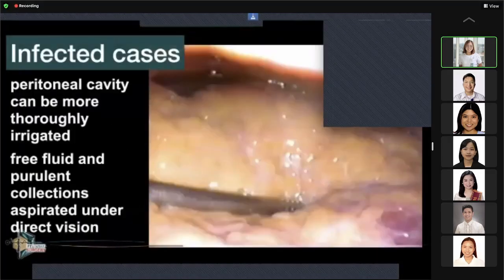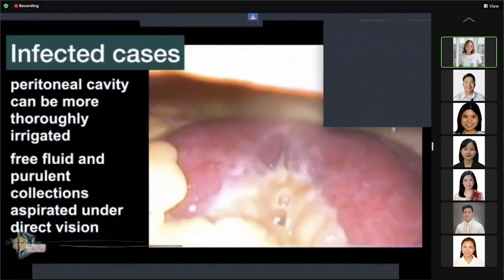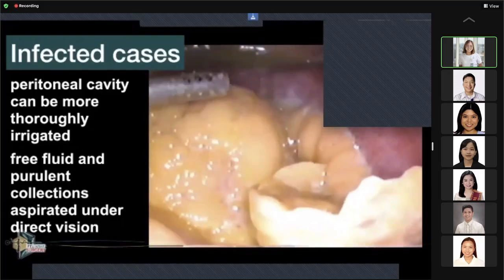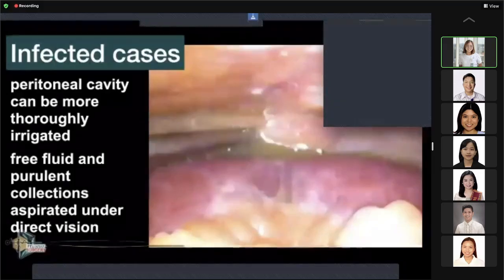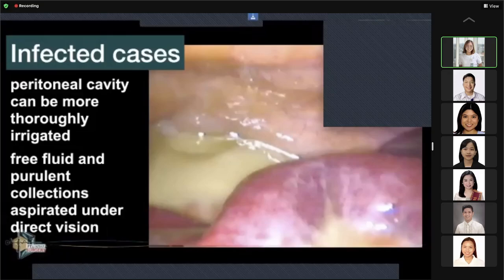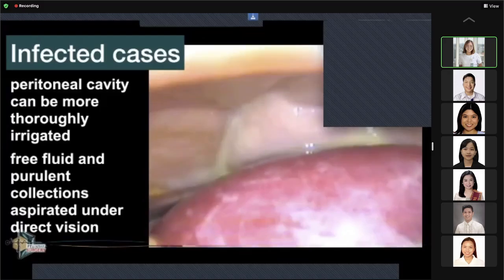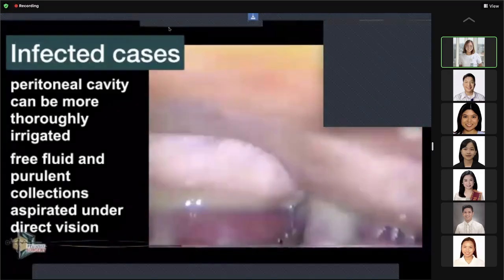So these are examples of laparoscopic surgery in an infected abdomen. So usually this is from a ruptured appendicitis. So from the initial picture I've shown you a while ago, you need to make a very long incision. So for laparoscopy, you have a 5 millimeter incision, at least 2 5 millimeter incisions, and the camera, 1 centimeter. So we have 3 ports.